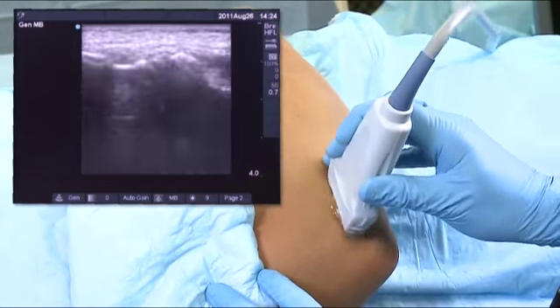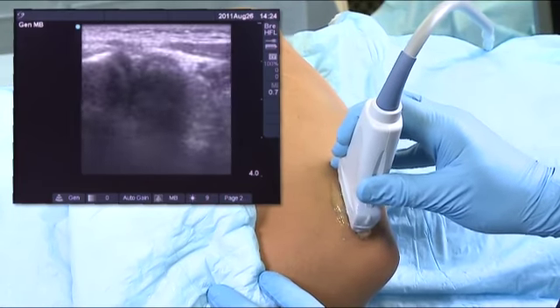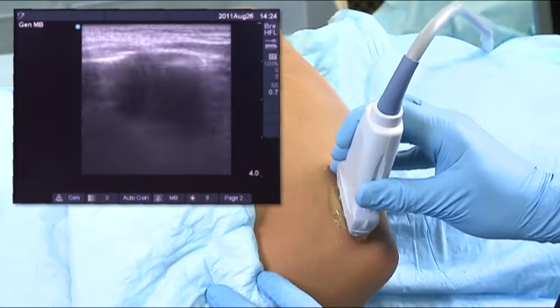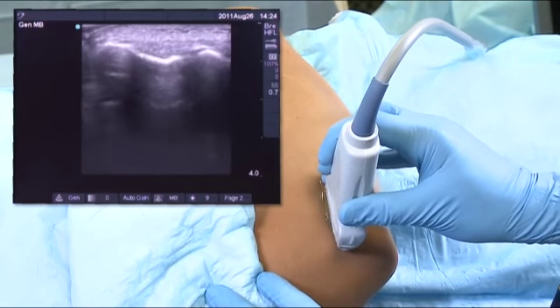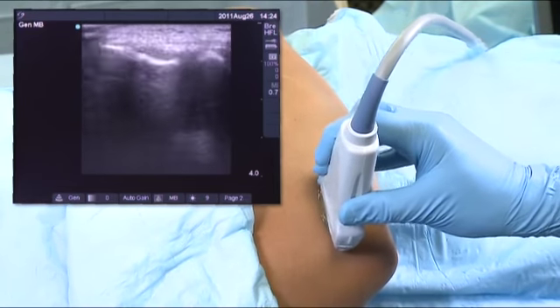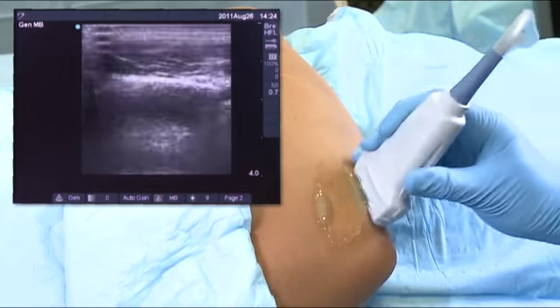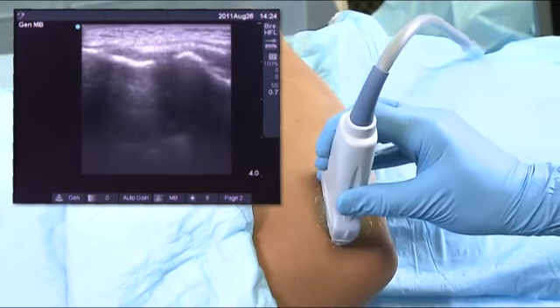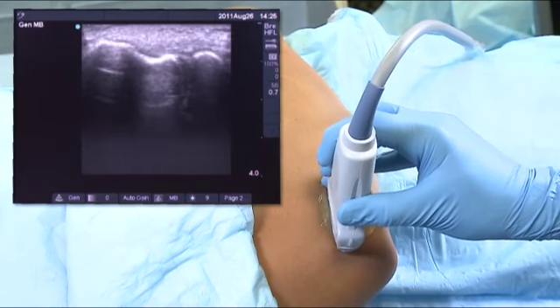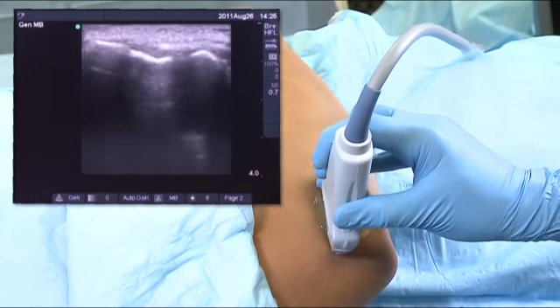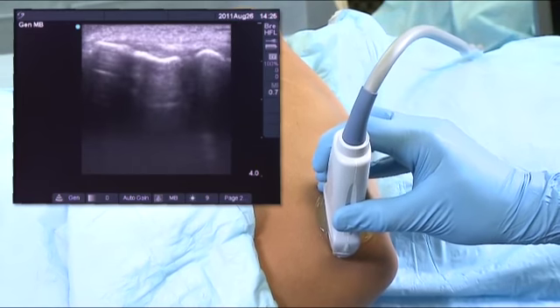Putting the transducer — and again the radial head you can see very clearly in the middle of the screen. As I move up proximally I can see the entire contour of the epicondyle in a longitudinal view, and I'm going to get a good view there where I can show you some of that disease that we're looking at.